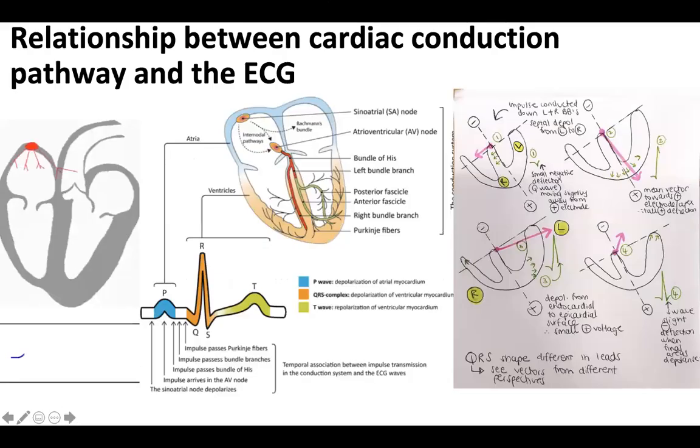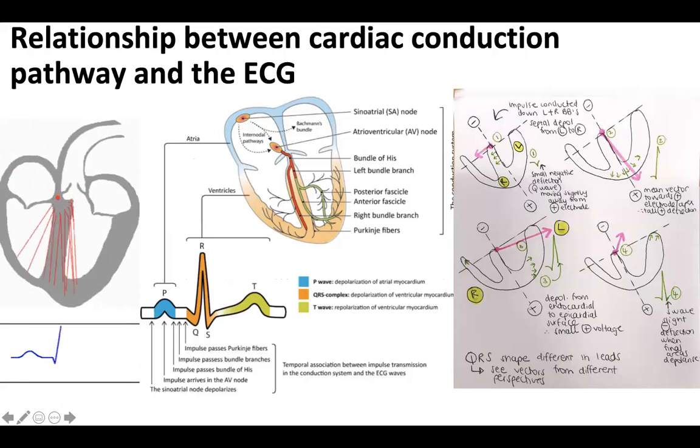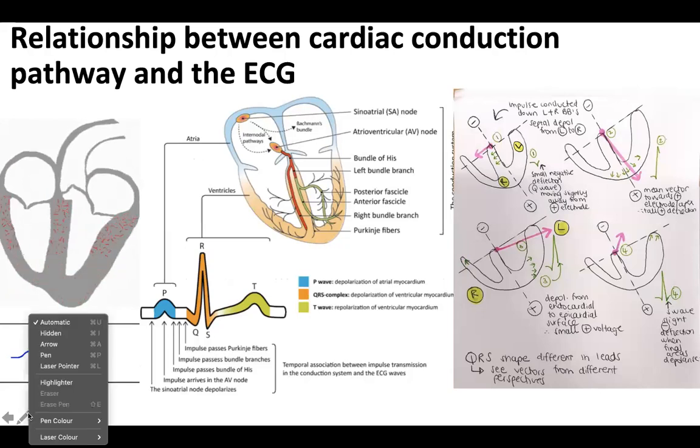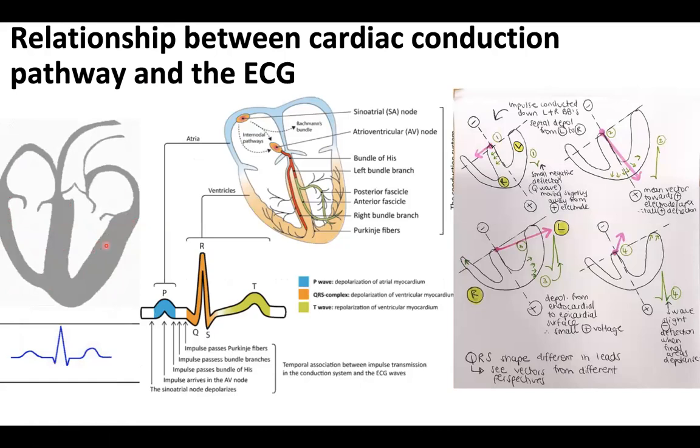Okay, so I'm gonna start off with ECGs. The first part of the talk might be an hour or just over an hour, and then hopefully Logan will have a bit of time to go through ABGs. But I just want to start with a bit of physiology. I'm just gonna get the laser pointer. Okay, so this is working quite well.